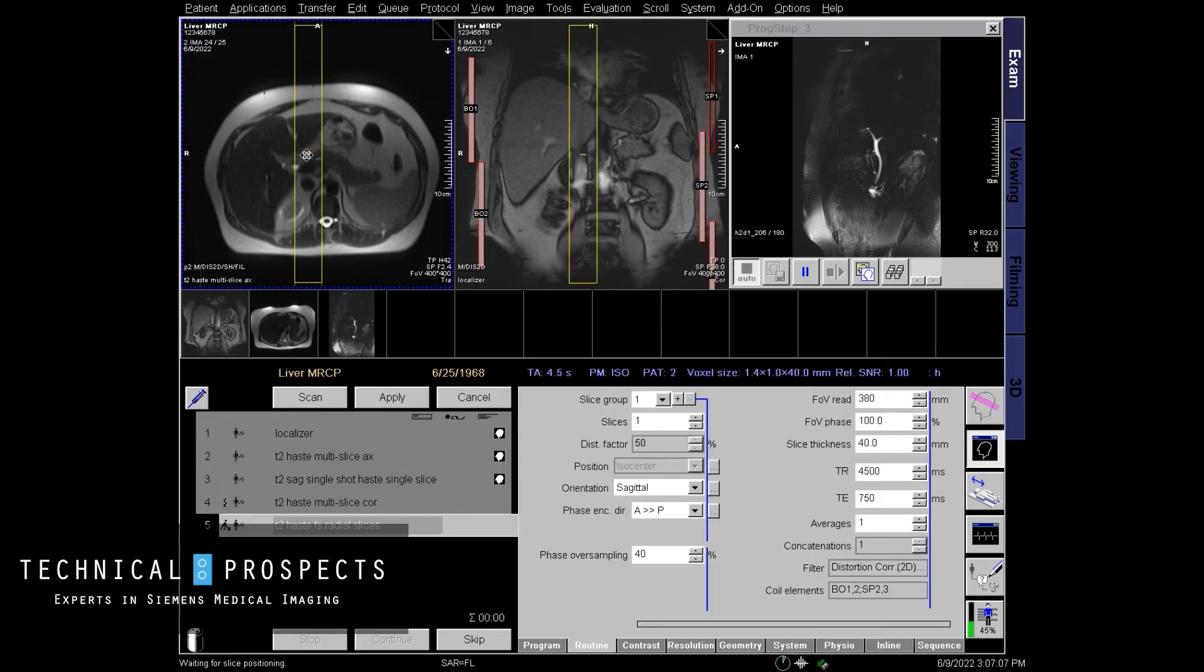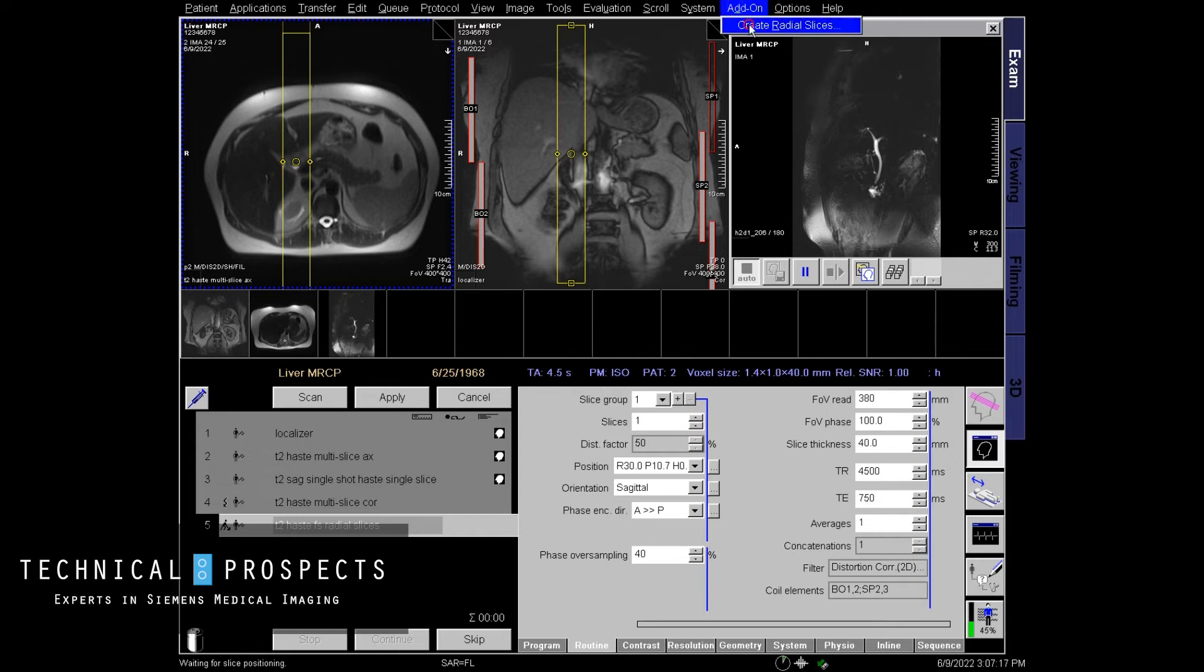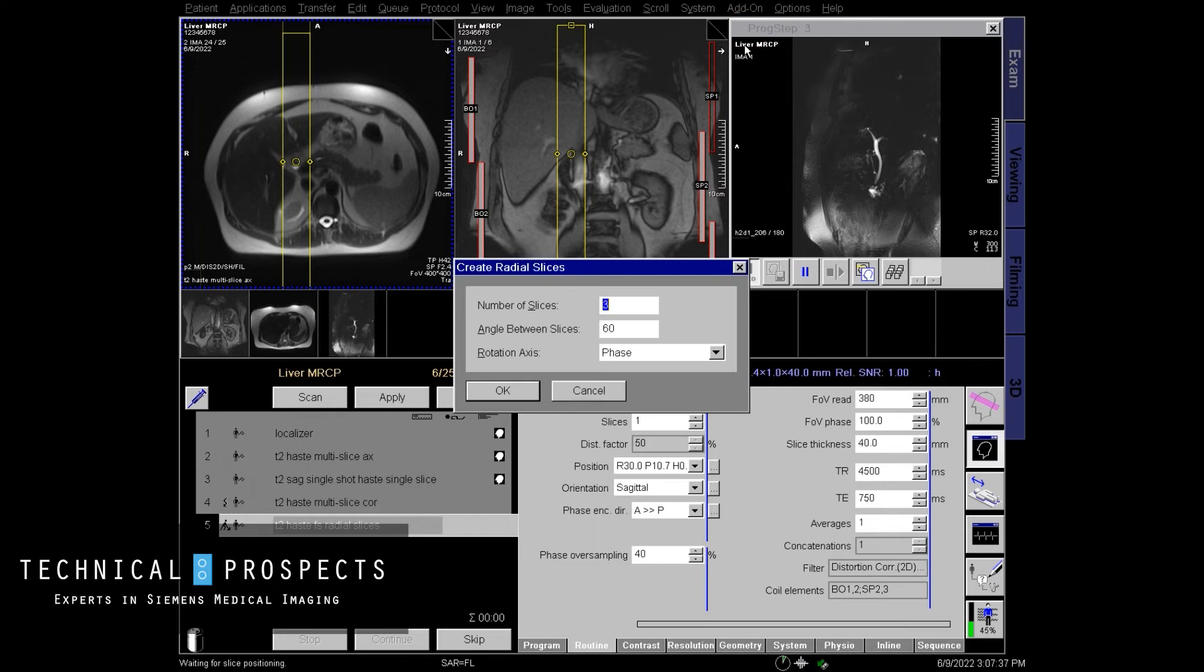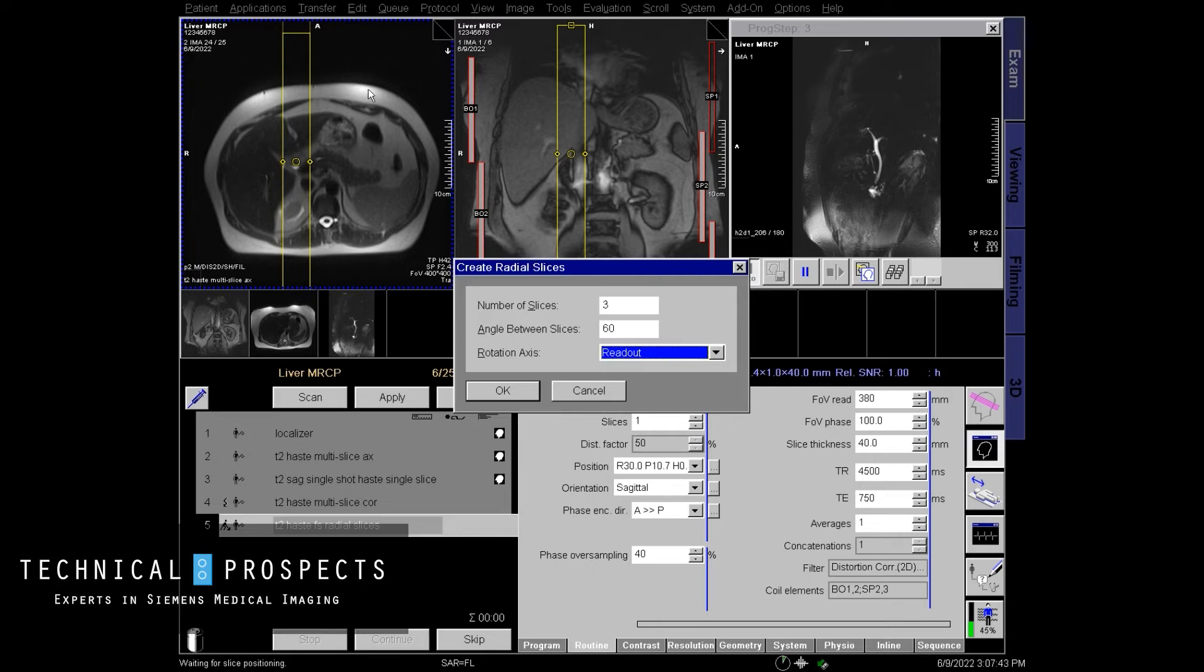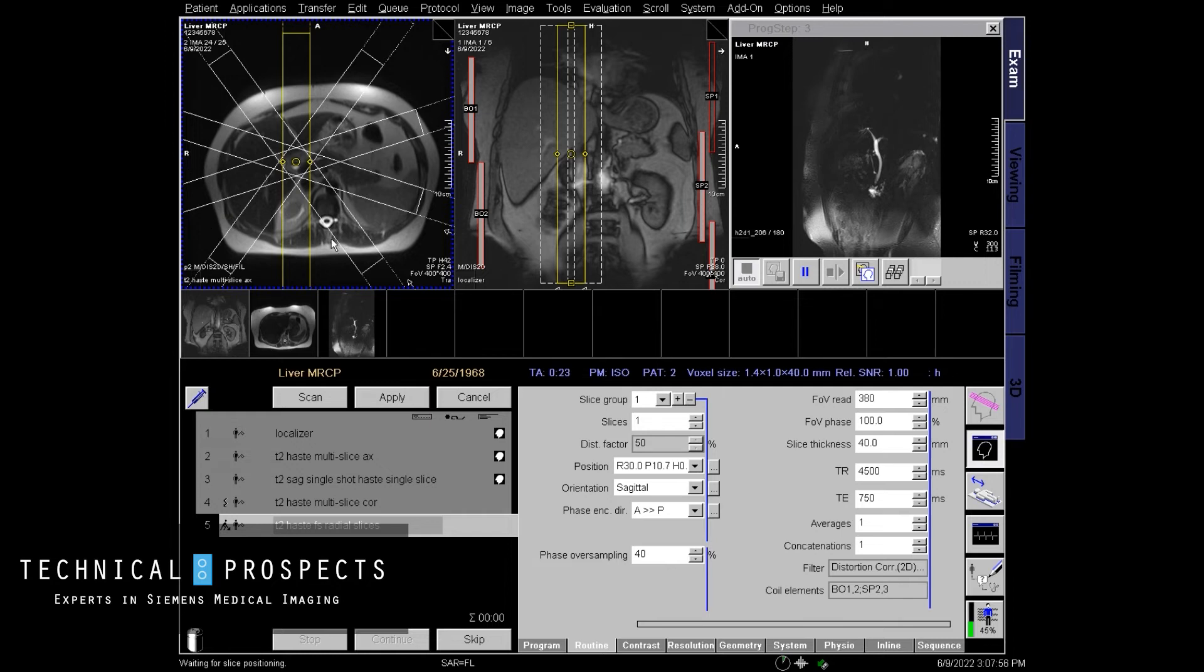Open up the sequence. Position your one slice over the biliary tree again, that little white dot. And then we're going to come up here and we're going to go to add on create radial slices, select readout because I'm on an axial image and you want readout for an axial image. I'm going to choose select five slices. And here are my radial five slices all being centered over the biliary tree.